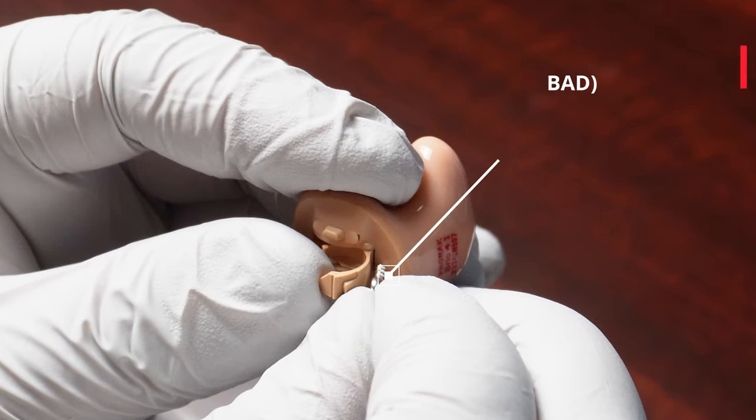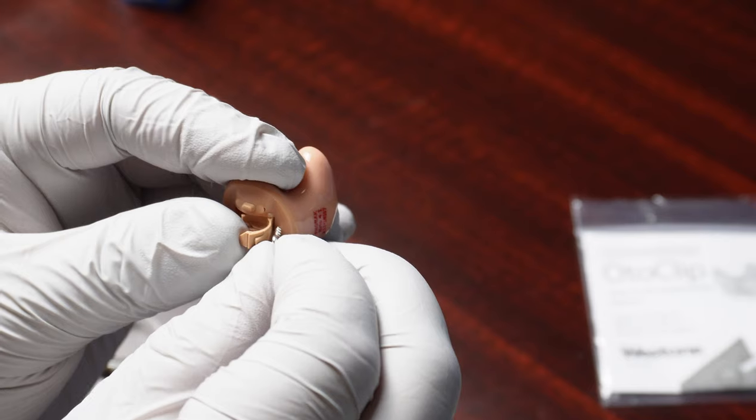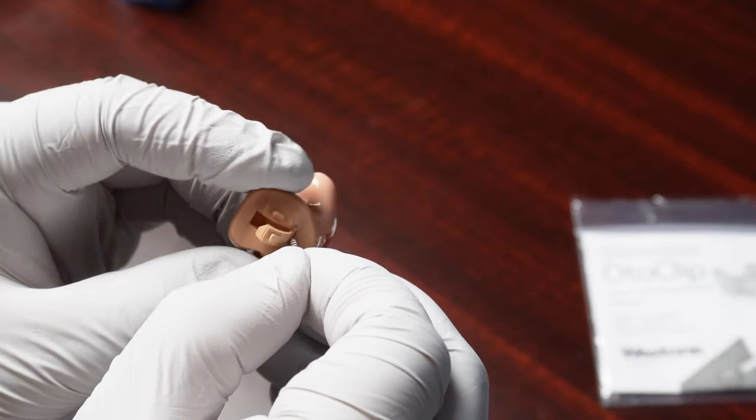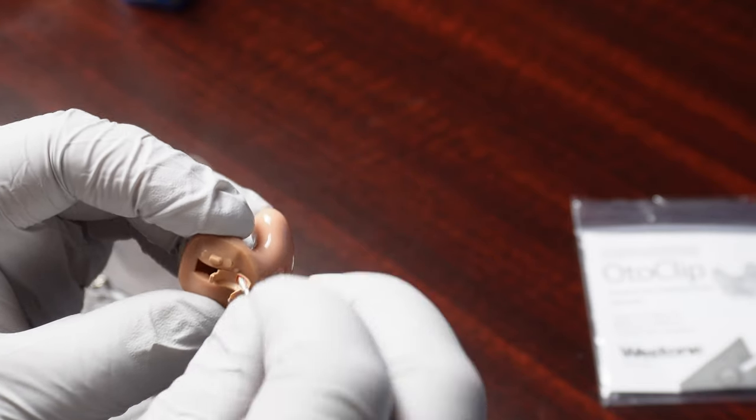If I were to drill a hole right here next to the battery door, then I wouldn't even be able to open the battery door. So that's not a good spot. And if I were to drill a hole above the battery door where the battery comes in, it would keep the battery from going into the battery door.